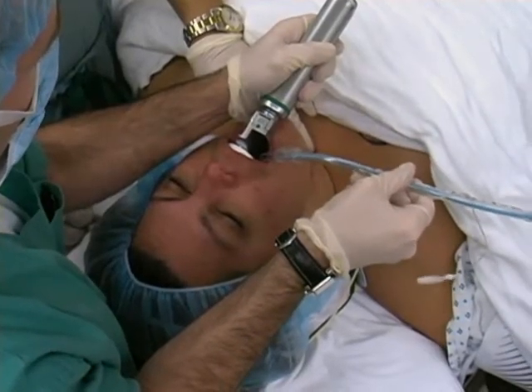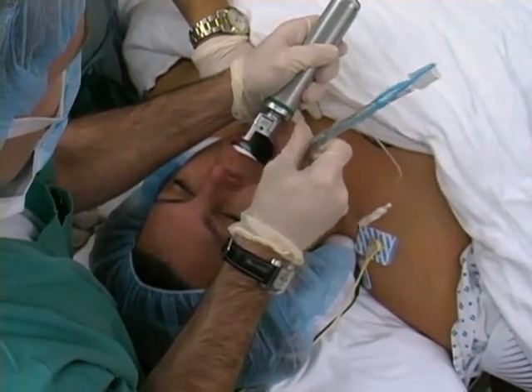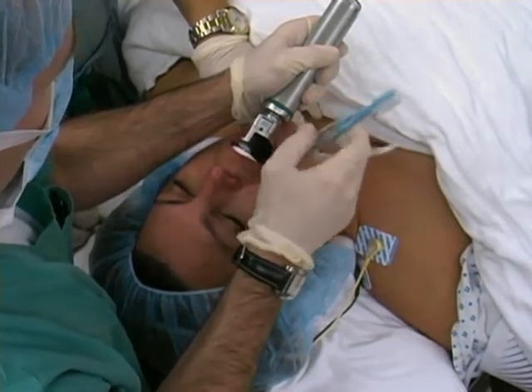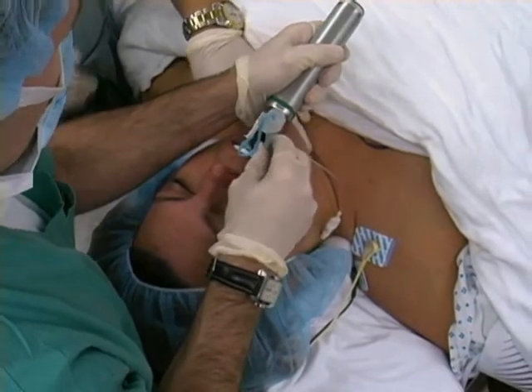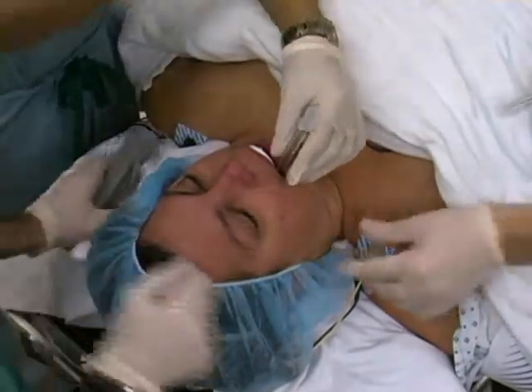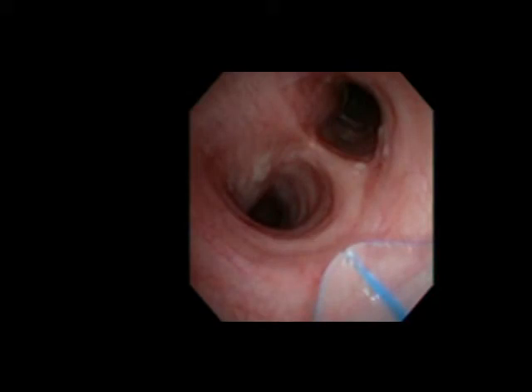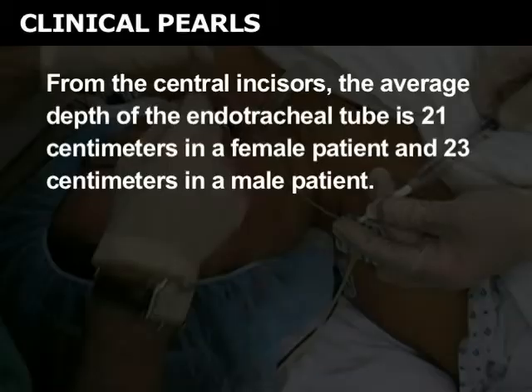Place the endotracheal tube in the right side of the mouth, advancing it toward the glottic opening. The tube should not obscure your view of the glottic opening, and you should watch the tube pass through the vocal cords. If a stylet is used, it should be removed immediately after the endotracheal tube passes through the cords. Continue to insert the tube to a depth two centimeters above the carina. From an endoscopic viewpoint, you can appreciate the appropriate depth of the endotracheal tube in relation to the carina. From the central incisors, the average depth is 21 centimeters in a female patient and 23 centimeters in a male patient.